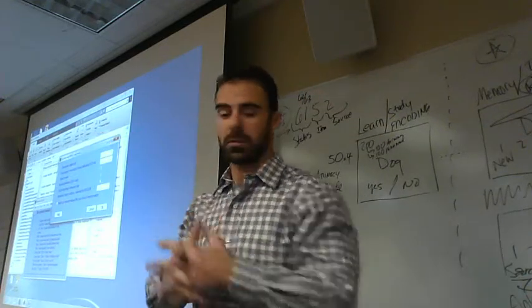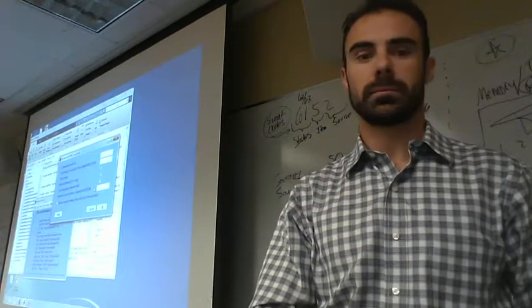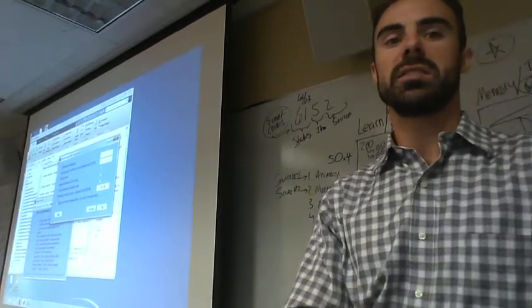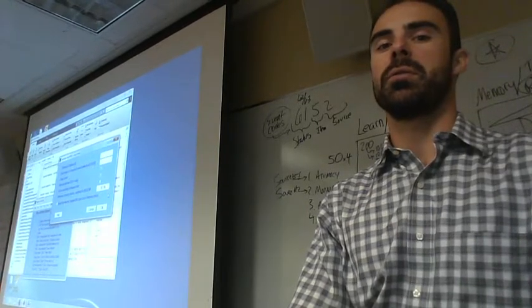Yes, question? Which file are we opening with the Biosig Toolbox? 4.bdf. So what I'm typing in here, it says reference chans indices required for Biosemi, and we're going to type in 33 and 34.